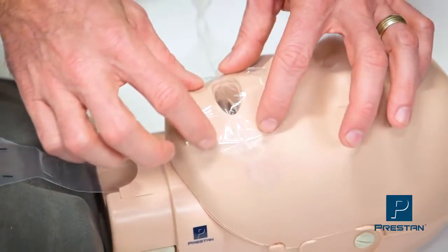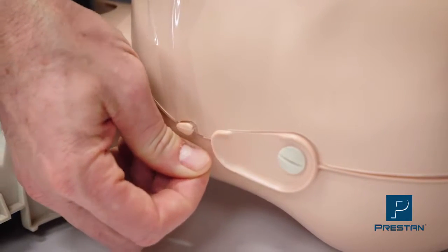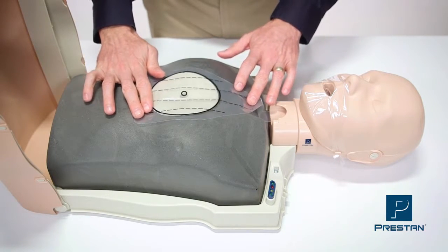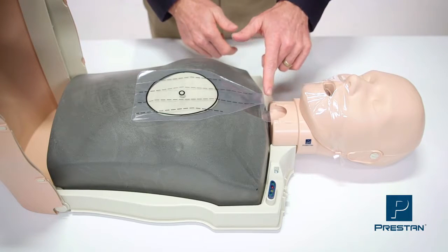Secure the face shield at the ear pins. Lightly tug on the lung bag to help open the mouth hole, then center the lung bag on the chest plate. The neck of the lung bag will have some slack.